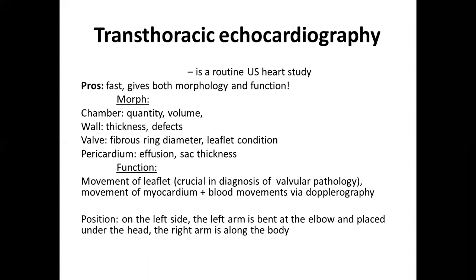So transthoracic echocardiography is a very important technique as a screening and in general. You can get very full information about the heart condition and the vessels condition.